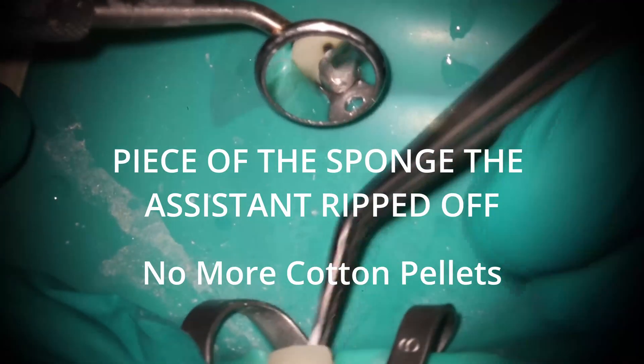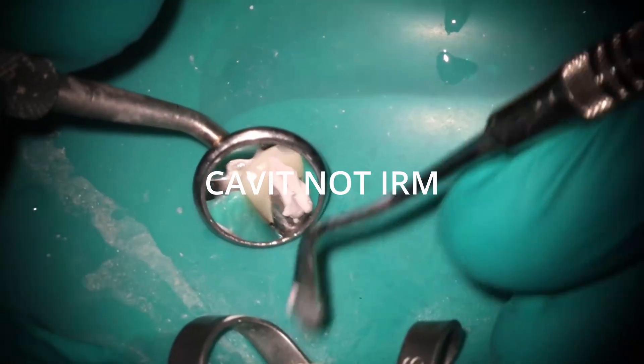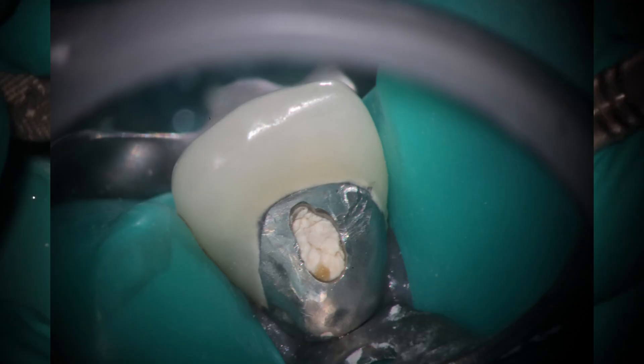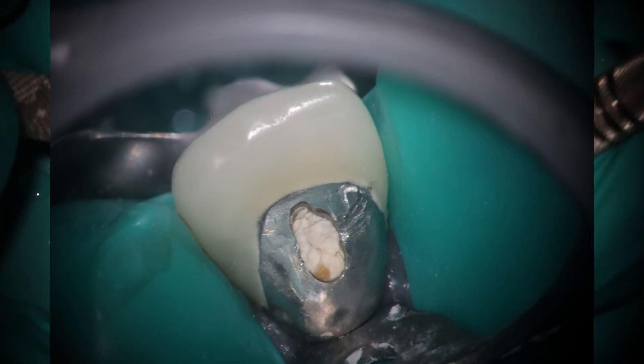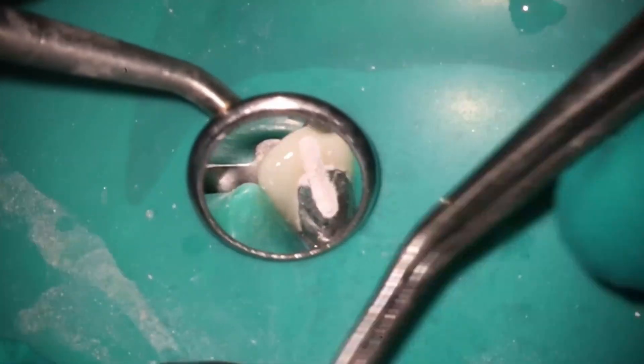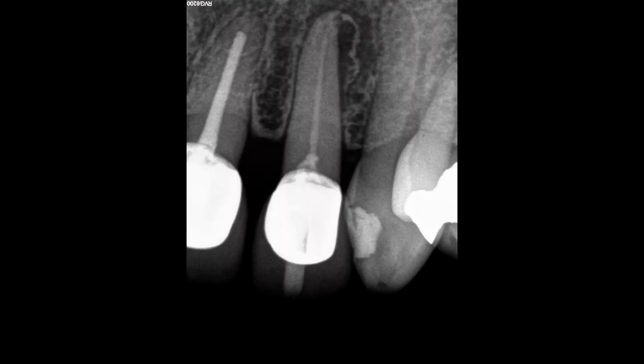Notice as I'm putting this Cavit in here, how the Cavit goes up to the incisal edge — pretty much to the incisal edge. And if we compare it to what it looked like before, you'll see that it was just a circle just inside the metal. A lot of people want to avoid getting into that area, but you can definitely see the difference. And when we take these x-rays, the Cavit now goes all the way through to the incisal edge on the x-ray.